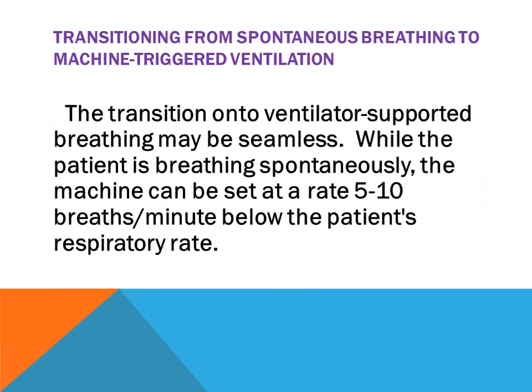Transitioning from spontaneous breathing to machine triggered ventilation: here the transition into ventilator supported breathing may be seamless and the patient breathes spontaneously. So we used to set the rate 5 to 10 breaths below the patient's respiratory rate.